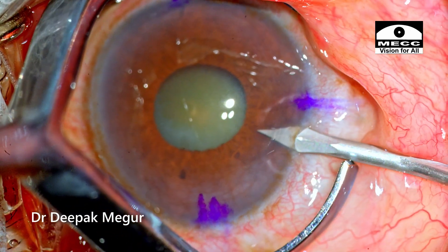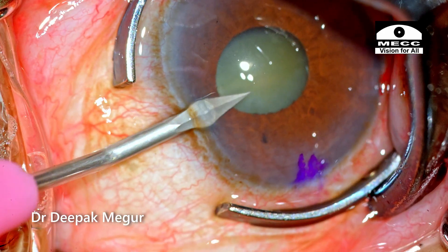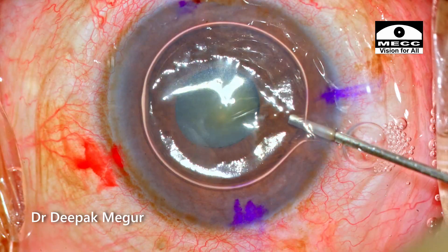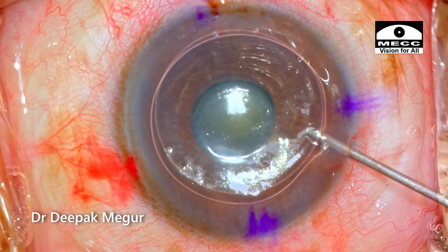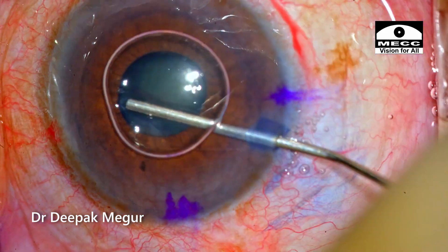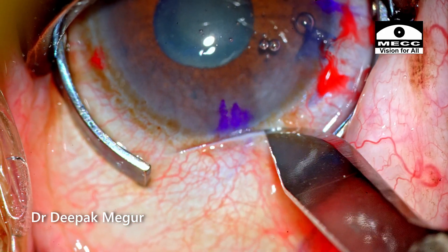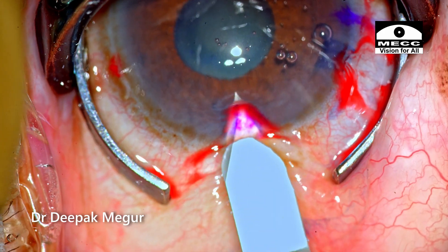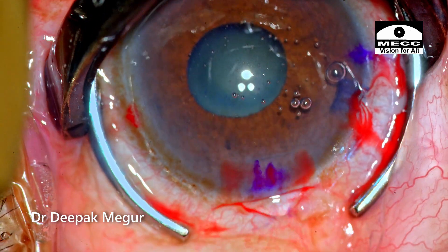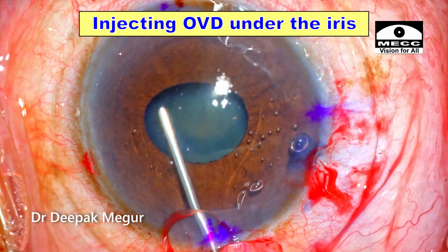The marks are a little thicker than I would have preferred. We begin the surgery by making the two side port incisions. Now the capsule is stained. OVD is injected into the eye, and I've positioned the main incision centered around the steep axis — it's around 4 degrees.